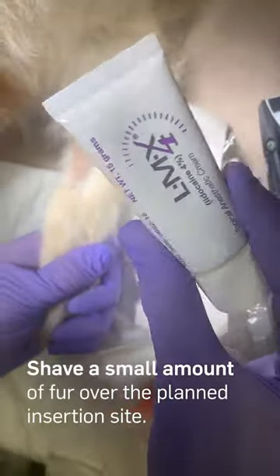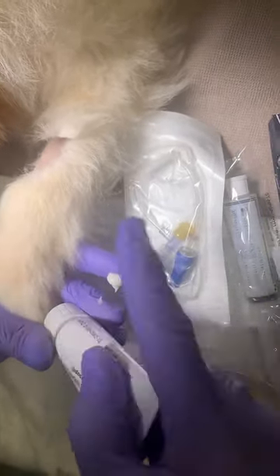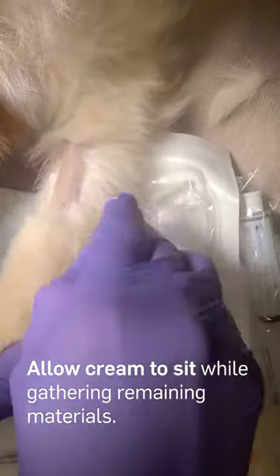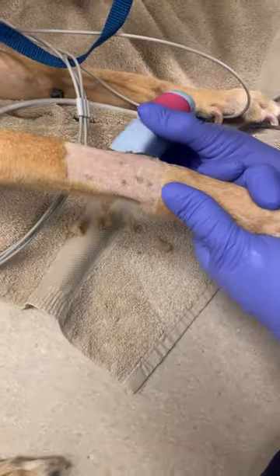Begin by shaving a small amount of fur over the planned insertion site. Apply LMX cream and massage it in to desensitize the insertion point. Allow this to sit while gathering remaining materials. Shave a large enough area to avoid dragging the IVC through the fur when inserting the catheter.